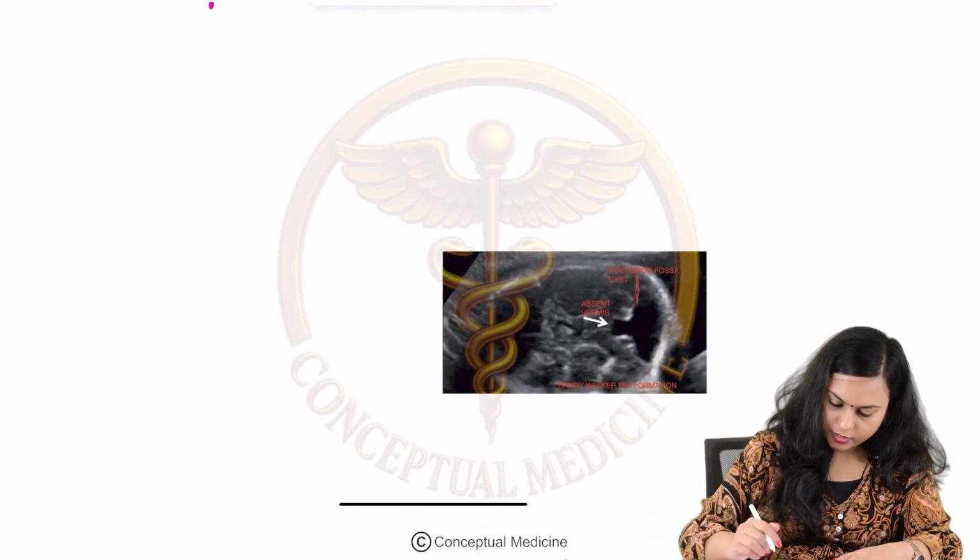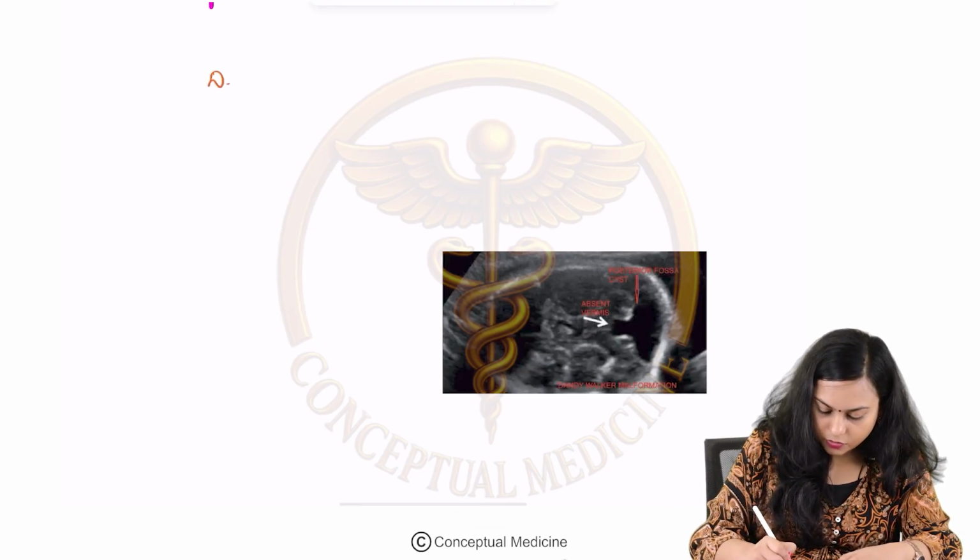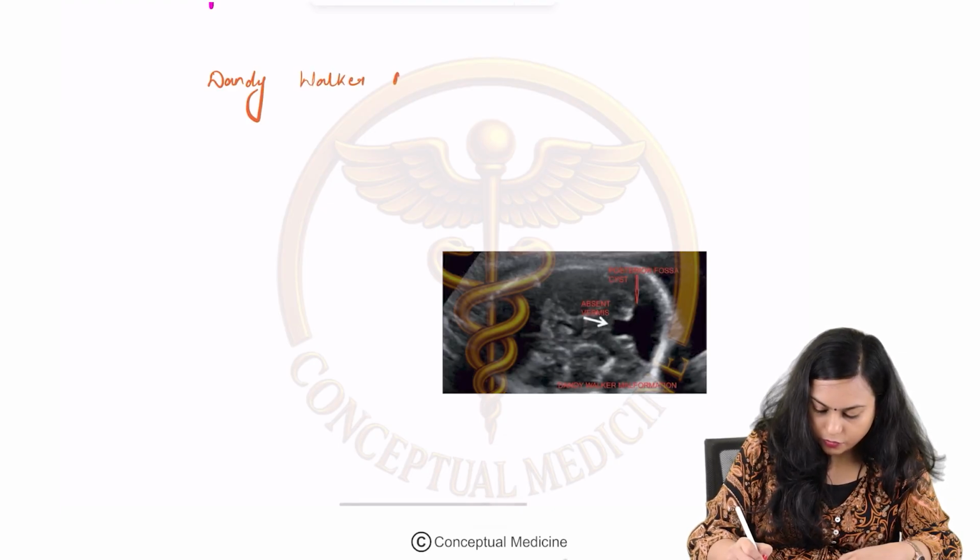And another one is, sometimes you will be able to make out some syndromes like Dandy-Walker malformation.